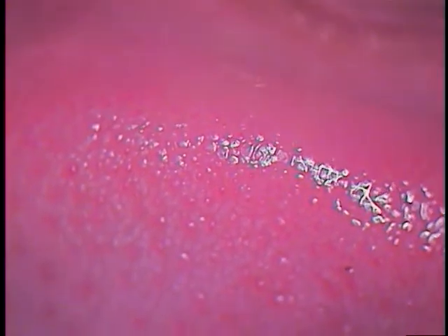And before we do that, we'll pre-soak. TNS solution is great, cleans the threads. My patient's going to let me know if he has any issues. We're okay. Now we're cleaning the threads.